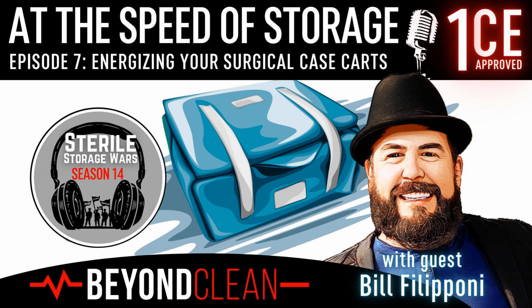Right. For folks, again, to really set the baseline, like put the cookies on the lowest shelf, as they say: these things are on wheels, right? So like you said, open and closed, and all those supplies, but it's important for this conversation to emphasize that this is moving storage. We're talking about Sterile Storage Wars, and this is one of the only things about storage that moves around. That obviously has an impact on how our departments interface with this, right? Yes. I think the hardest part is tracking that storage, having the ability to track it from one area to the next.